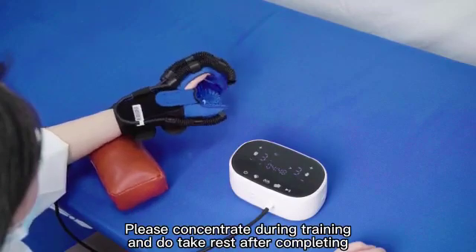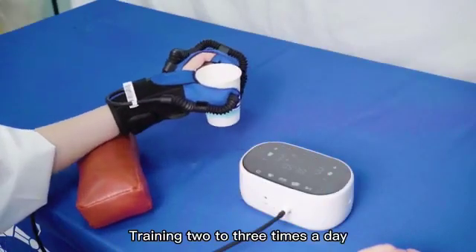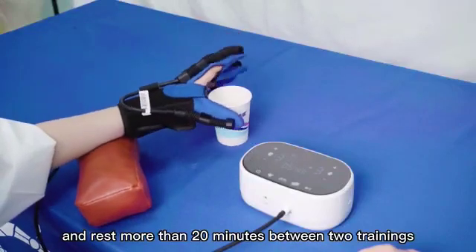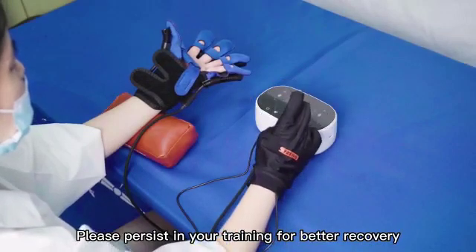Please concentrate during training and do take rest after completing training two to three times a day. Rest more than 20 minutes between two trainings. Please persist in your training for better recovery.